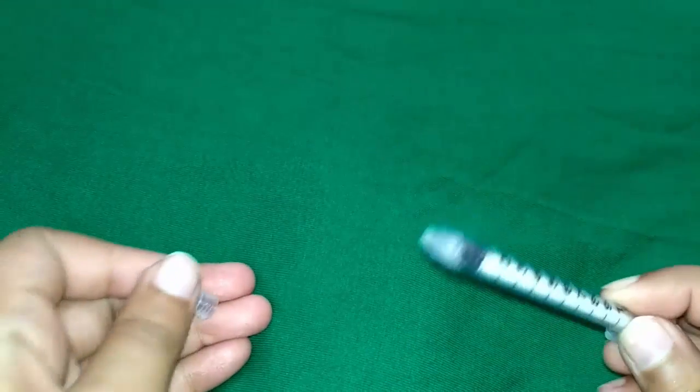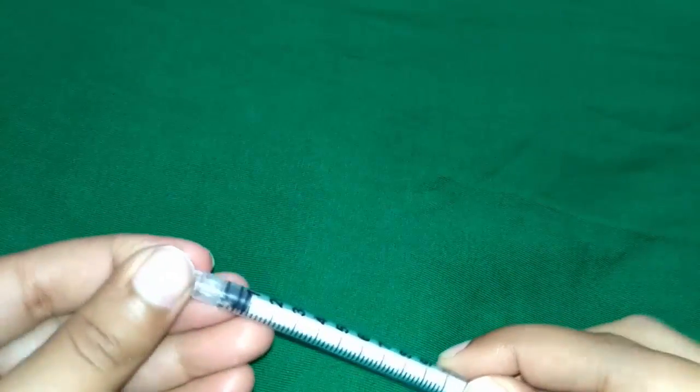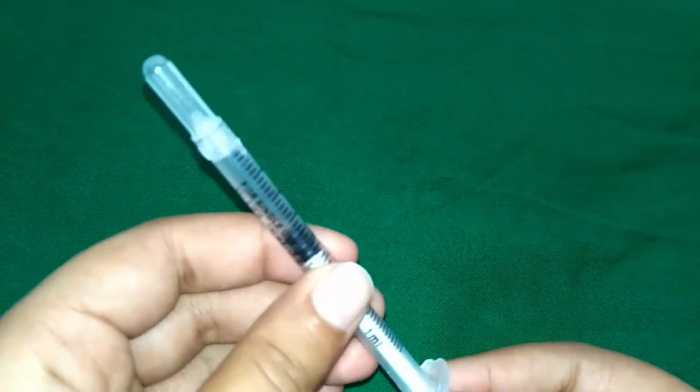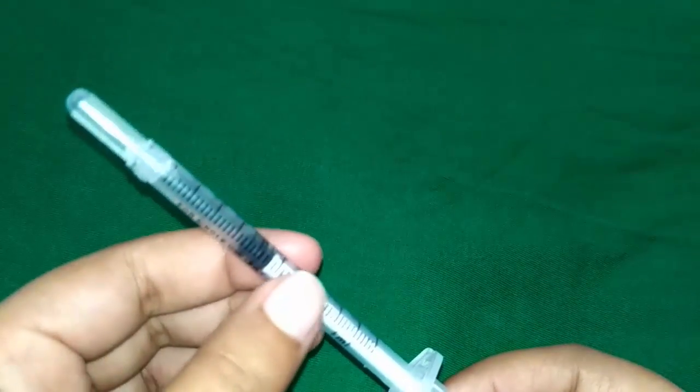The silicone coating allows the needle to pass through the skin easily and with less pain. This is the barrel — it is a long, thin, cylindrical chamber that holds the insulin. It is marked with lines to measure the number of insulin units.